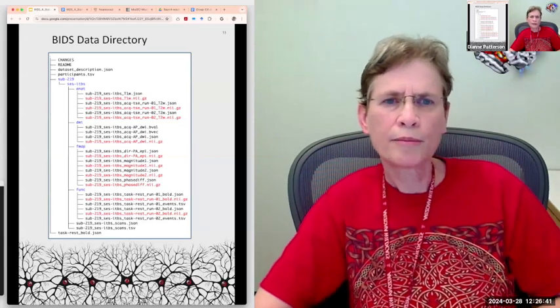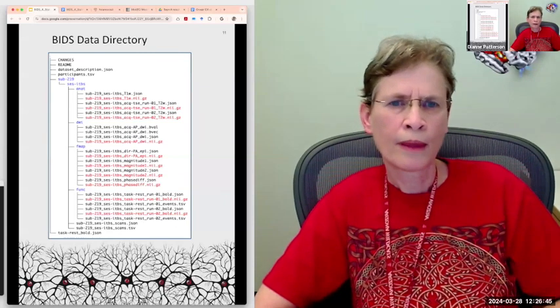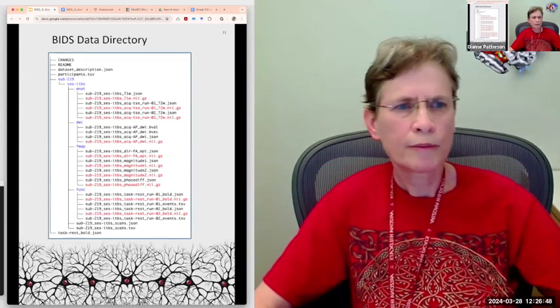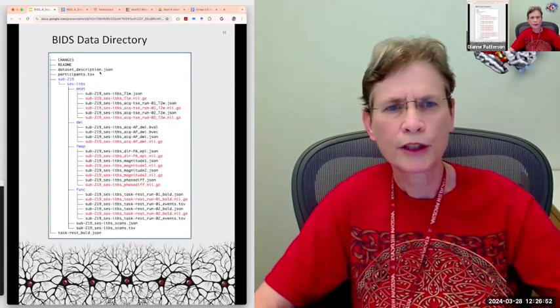Okay, so here's a BIDS data directory containing one subject with a session. The required descriptive files up here, changes, readme, dataset description, those have to be there and they have to be named this way.